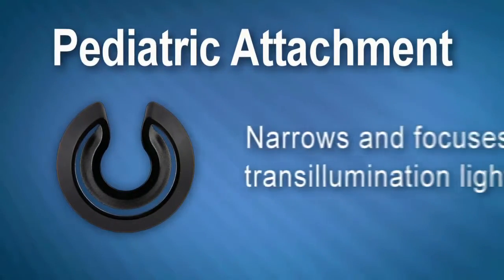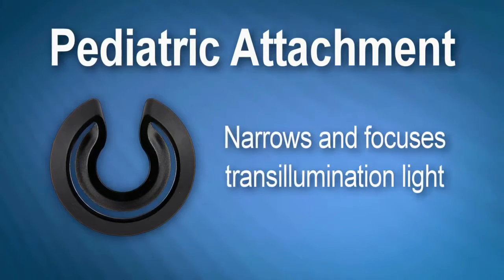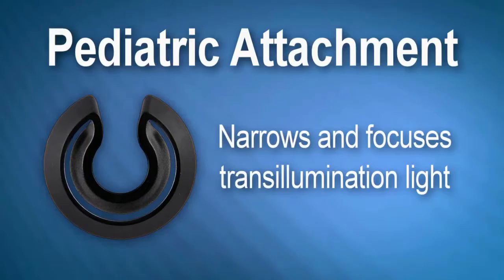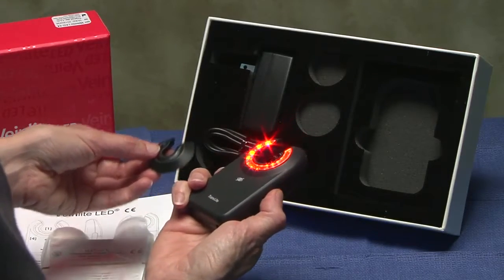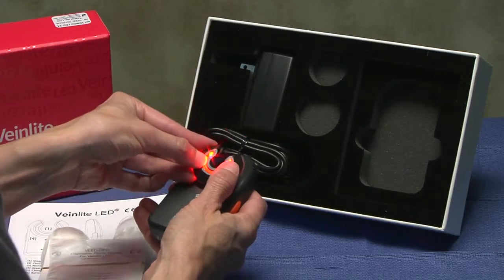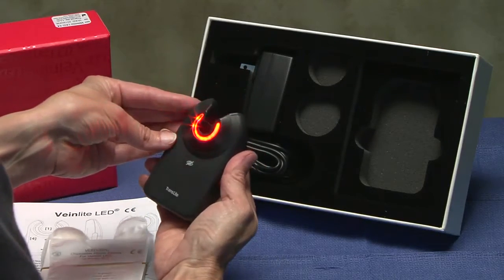The pediatric attachment is used to narrow and focus the transillumination light onto a smaller area more appropriate to infants, babies, and elderly small bone patients. To use the pediatric attachment, align the opening of the adapter with the opening of the device on the side where the LEDs illuminate. Place the wider side of the adapter over the clear window, press down, and you will feel it snap into place.